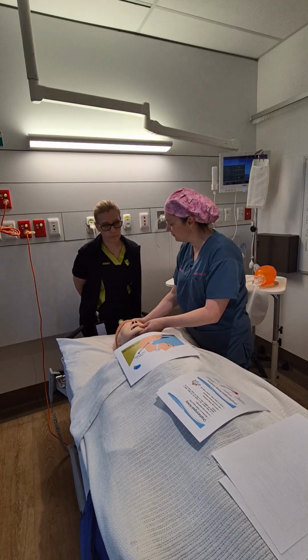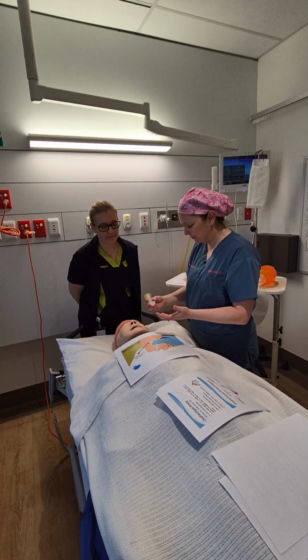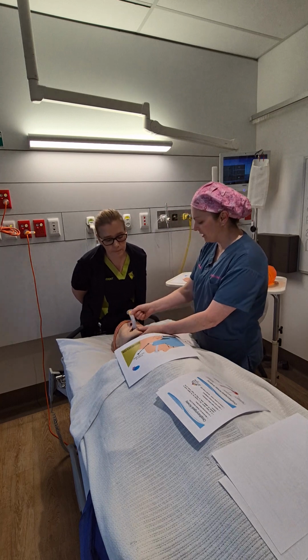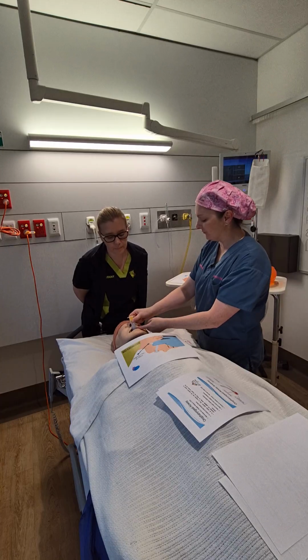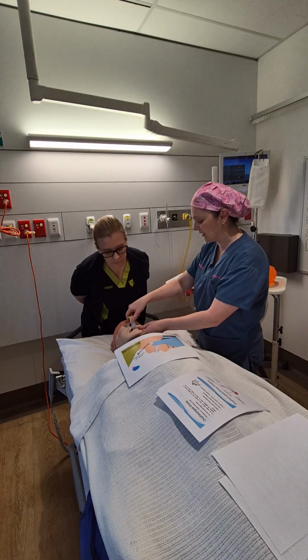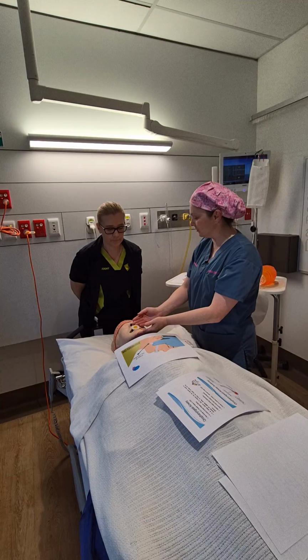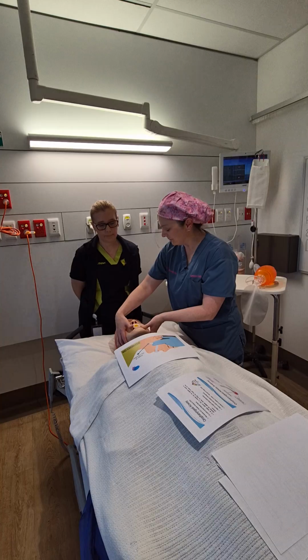No worries. Do you know how to insert one at all? No. No? Wonderful. Well, not wonderful, but that's okay. The easiest way to do it, you stick it in upside down. So you can do a little bit of jaw support or head tilt to help. We open the mouth, we stick it in there, so this bit will push the tongue down as we go in. And then we feel the back of the palate. We don't want to push it because we don't want to damage the palate. But once we get to there, we turn it. As we turn that, we can see that we're pushing the tongue out the way, and then you keep going and you insert it till you get to the top of the lips. And then with that, you can do some jaw support to help open the airway as well.